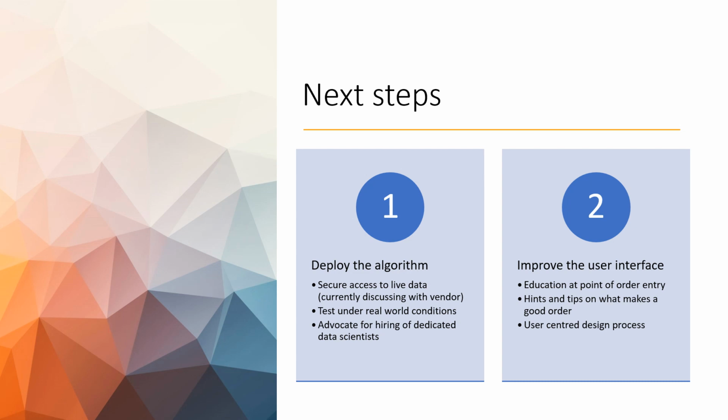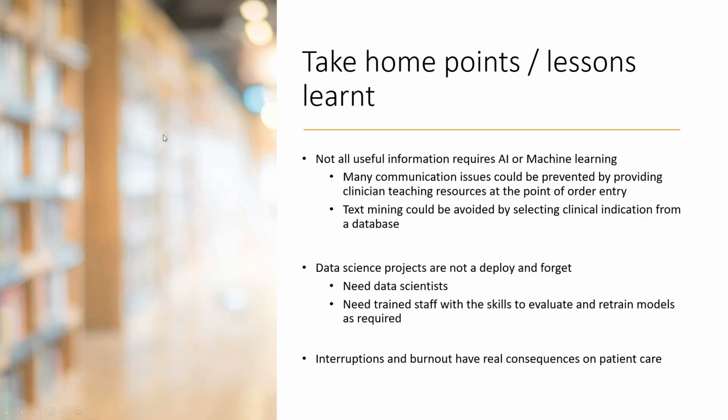And they should work alongside clinicians. The second thing I want to improve is the user interface. So when a new doctor orders a CT scan, it should be more intuitive. You should tell them what information that they put in. And if things change, like when COVID came in and we want new information, that should be prompted to the users then as well. So, as I said, not all changes need fancy AI or machine learning.